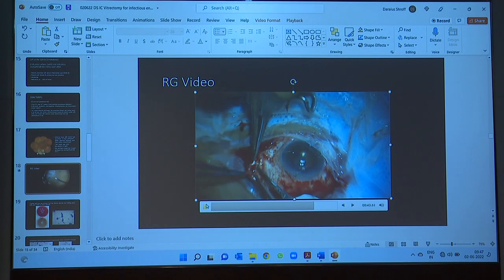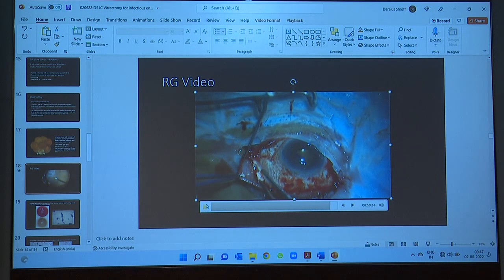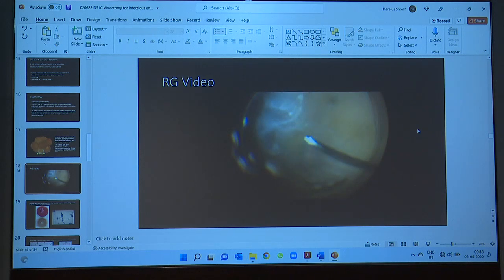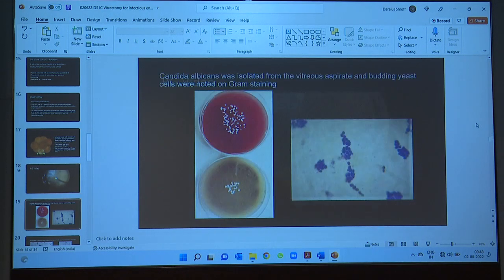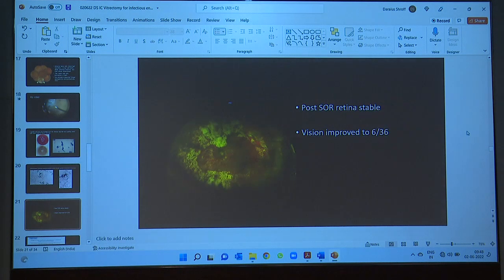The most shocking part came when we were closing — the fellow pointed out white material coming out in the episcleral space. I wondered if this was fungus coming out, so we took a sample and sent it to the lab. Notably, the abscess was at six o'clock inferiorly, but this white material was coming from the superior aspect. Candida was ultimately isolated from the vitreous aspirate with budding yeast. Outside, there were beautiful crystalline crystals of triamcinolone acetonide — this was a fungal endophthalmitis patient who had been given more steroids. Post-operatively the patient did relatively well with 6/36, the retina attached and stable.